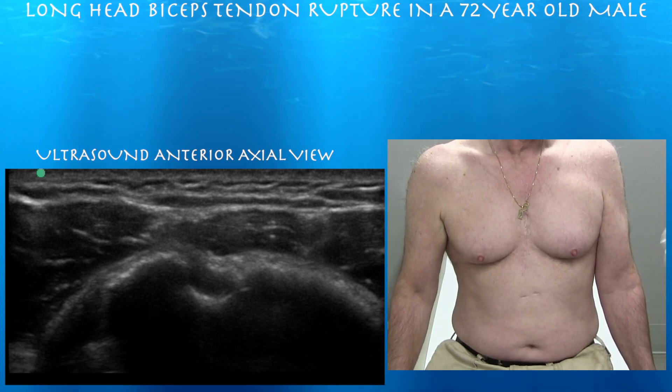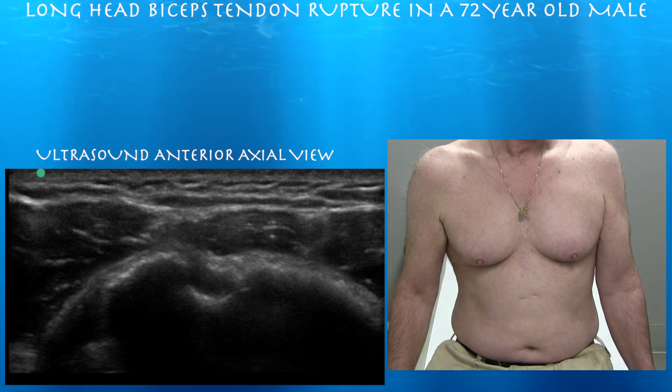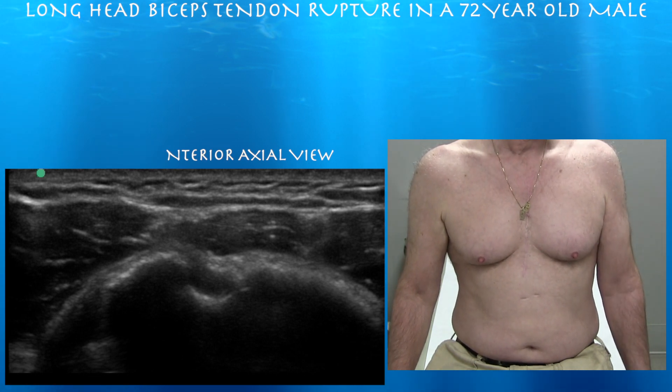He's really got good motion and strength in the shoulder. This is really just to confirm our clinical suspicion of a biceps tendon tear — a proximal biceps tendon tear.